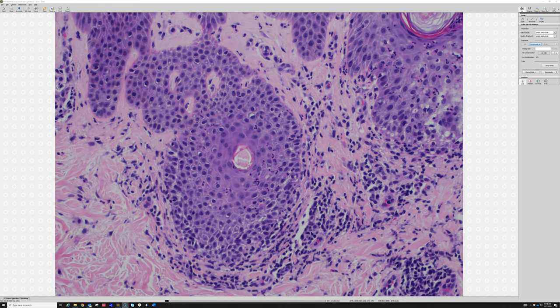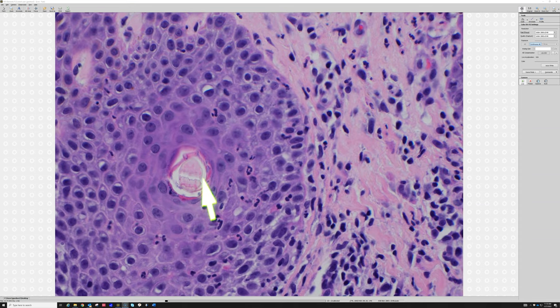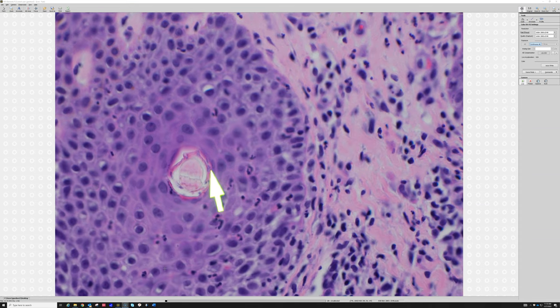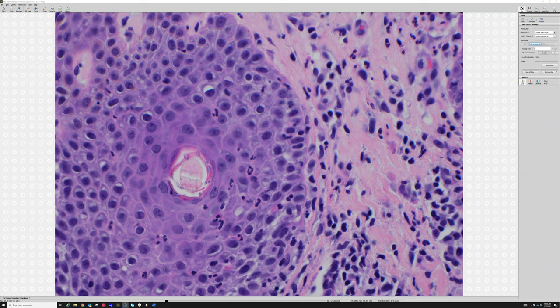Here's another follicle with a little bit more of the same — some fungi here. Majocchi's granuloma is often on the anterior legs; that's where you tend to see this for some reason.